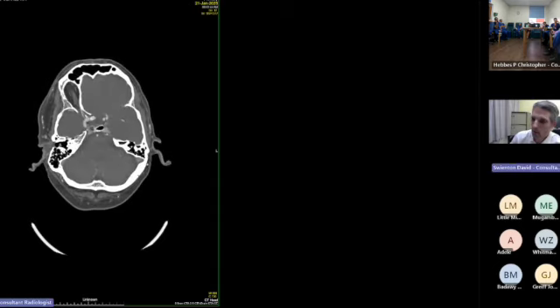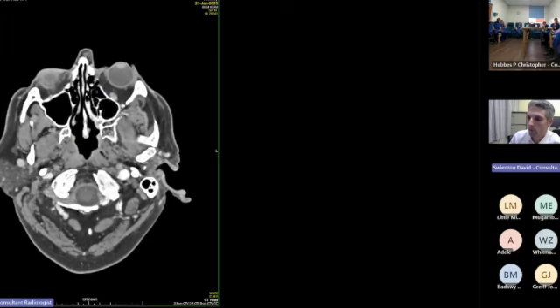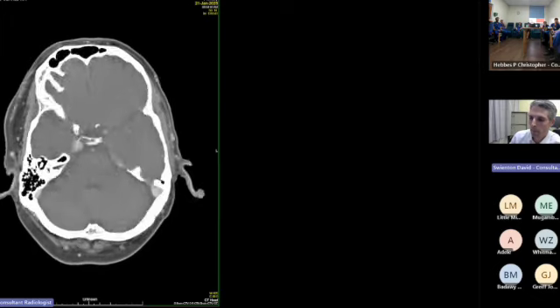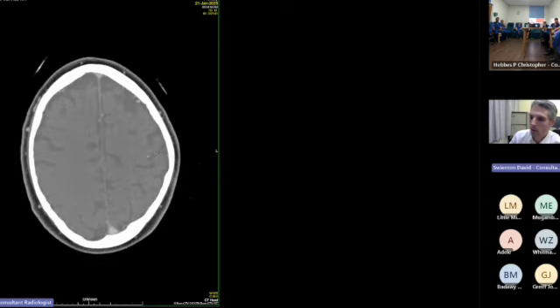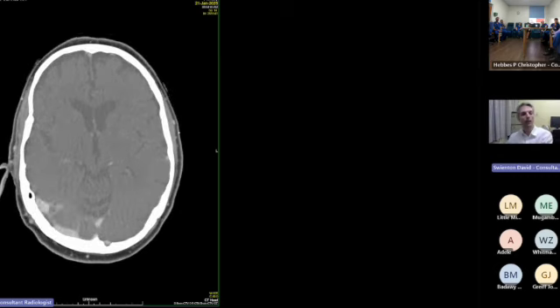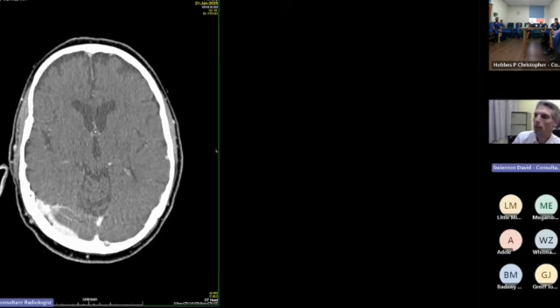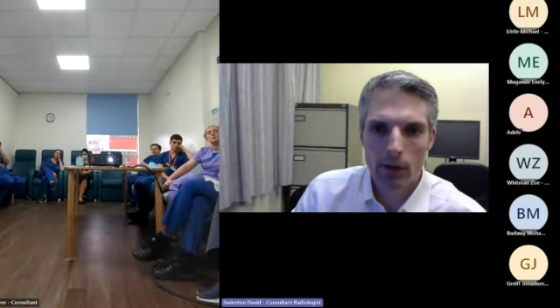And you can see that at this stage we haven't got much contrast in the distal parts of the transverse sinuses, and that's because the timing isn't there. But if we use the CTV, which was taken a bit later, you can see how beautifully opacified those transverse sinuses are, and you can see your internal cerebral veins again. And what you see now is these larger vessels are actually veins. So this isn't the superficial temporal branches. Again, you have to be careful with what you're looking at and how you interpret it, following things back and forth. So that's a normal from a brain death point of view. Obviously, he had a stroke, but it was a useful example because of the similar phases of the study.